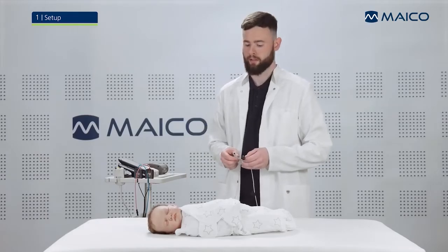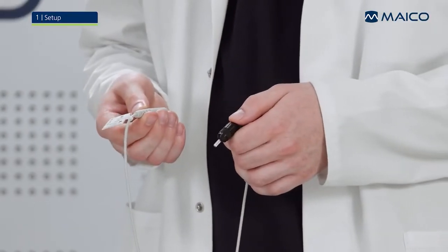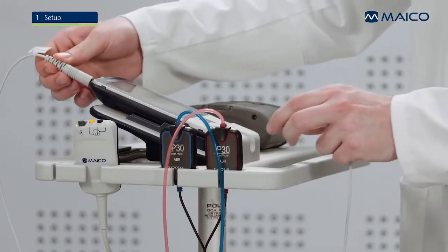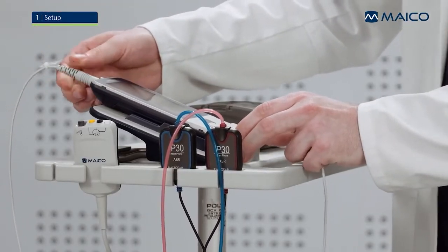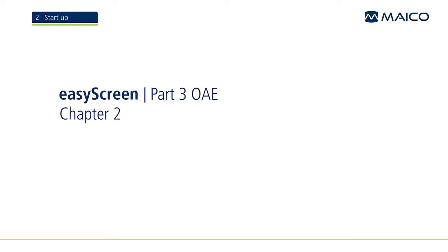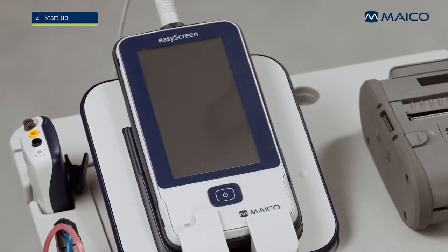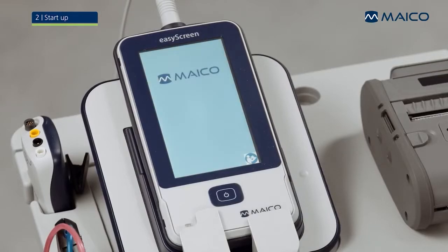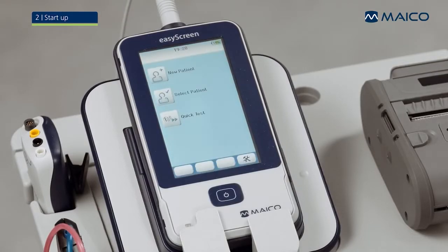The OAE Probe has to be connected to the EasyScreen. Search for the dot on the connector and push the plug straight into the socket. Press the home button on the EasyScreen once and wait until the home screen is displayed. Now the EasyScreen is ready to go.